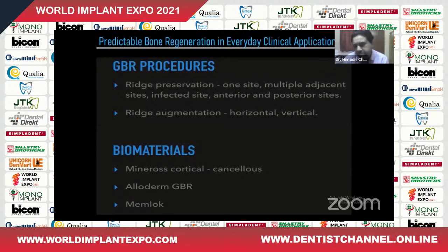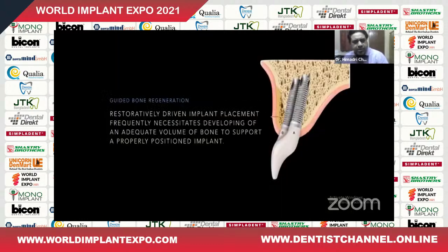Either it is a Gore-Tex membrane, or it can be broadly divided into resorbable and non-resorbable membranes. But most of the times nowadays, unless it's a very big volume augmentation, we don't do non-resorbable membranes. Mostly it's resorbable membranes. So we're going to discuss all these things a little bit more, because I'm not going to go into detail of the theories too much, but I want to show you more and more number of cases. So guided bone regeneration, why is it required?